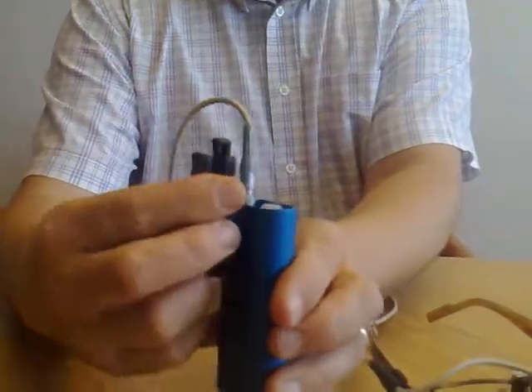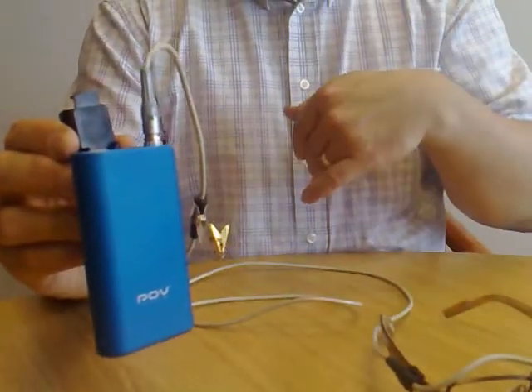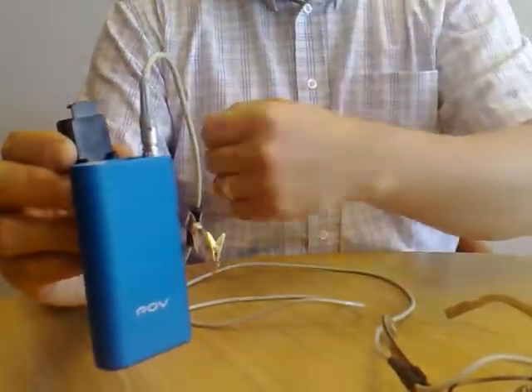You hook it on as you would expect and then attach that to your buckle. It's got an extra clip here so the wires don't get in the way, so you can put that where you want on your dress.